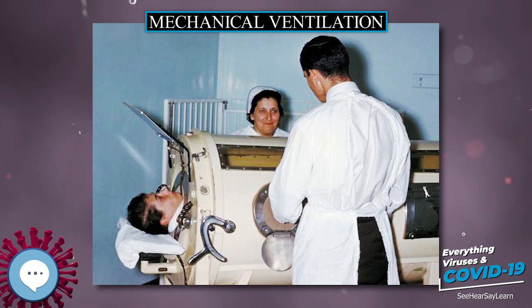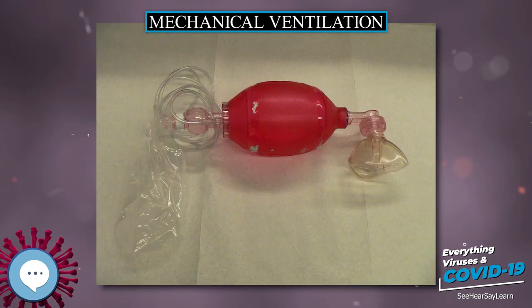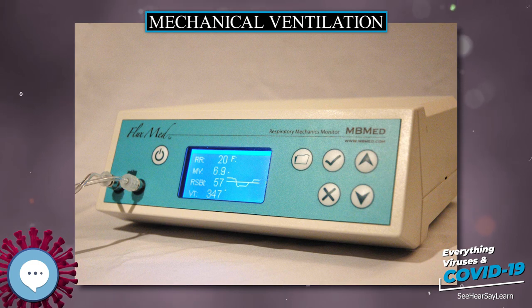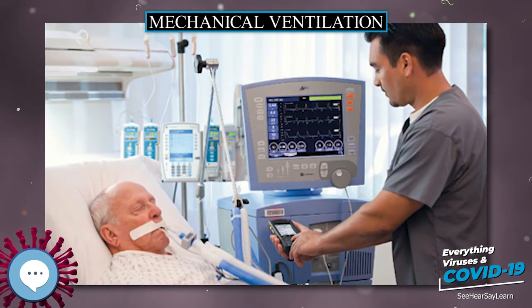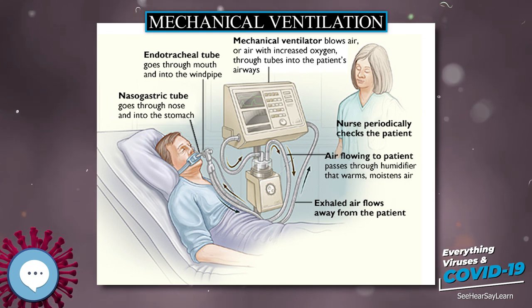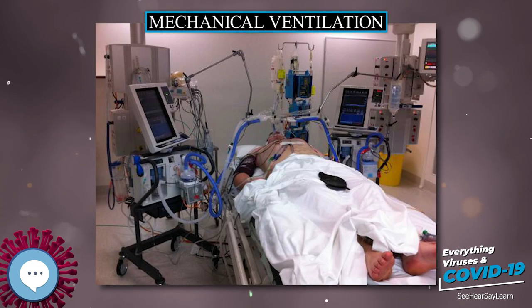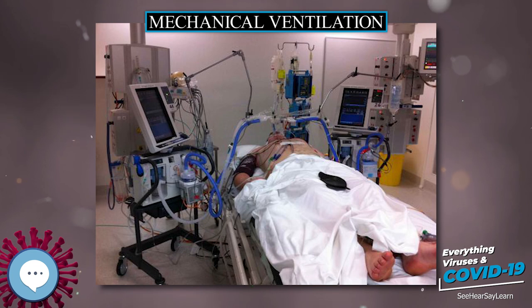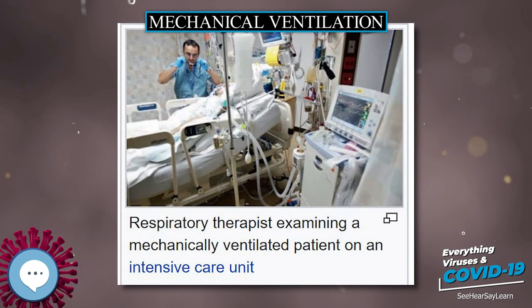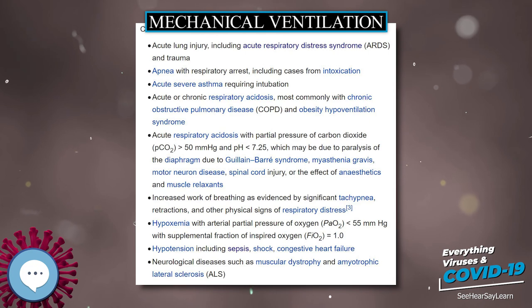One of the main reasons why a patient is admitted to an ICU is for delivery of mechanical ventilation. Monitoring a patient in mechanical ventilation has many clinical applications: enhancing understanding of pathophysiology, aiding with diagnosis, guiding patient management, avoiding complications, and assessment of trends. In ventilated patients, pulse oximetry is commonly used when titrating FiO2. A reliable target of SpO2 is greater than 95%. Different strategies exist to find the level of PEEP in patients with ARDS, guided by esophageal pressure, stress index, and static airway pressure-volume curve. Some experts recommend limiting PEEP to low levels, approximately 10 cmH2O. In patients who have diffuse loss of aeration, PEEP can be used provided it does not cause the plateau pressure to rise above the upper inflection point.